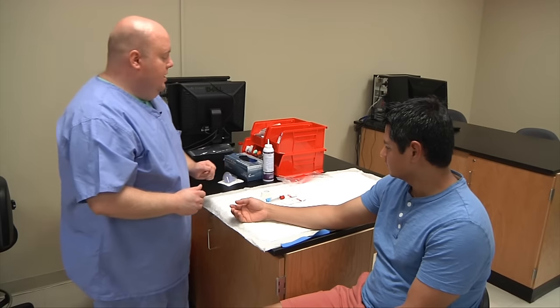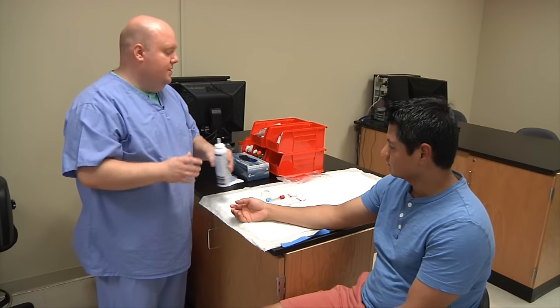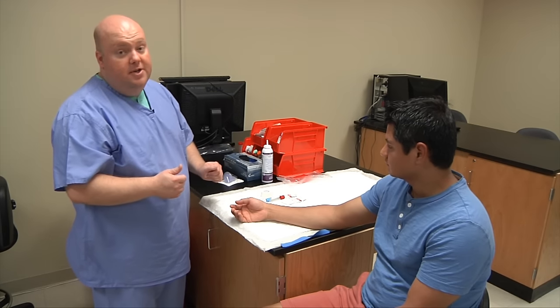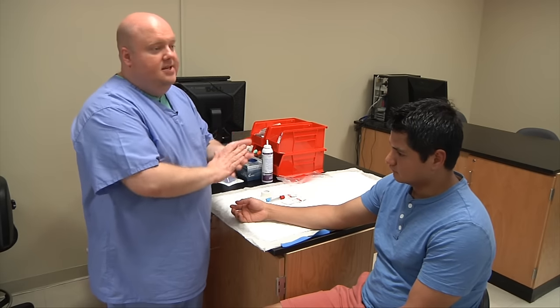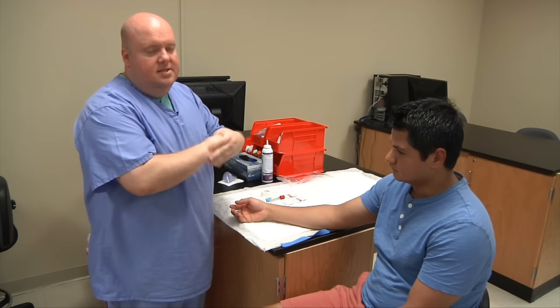What you'll want to do first is hand sanitize your hands. If you do not have hand sanitizer available, you'll need to wash your hands at a sink, humming 'Happy Birthday' twice to yourself to make sure you wash your hands long enough. With the hand sanitizer, you put a small amount in your hand and rub your hands until they're dry.